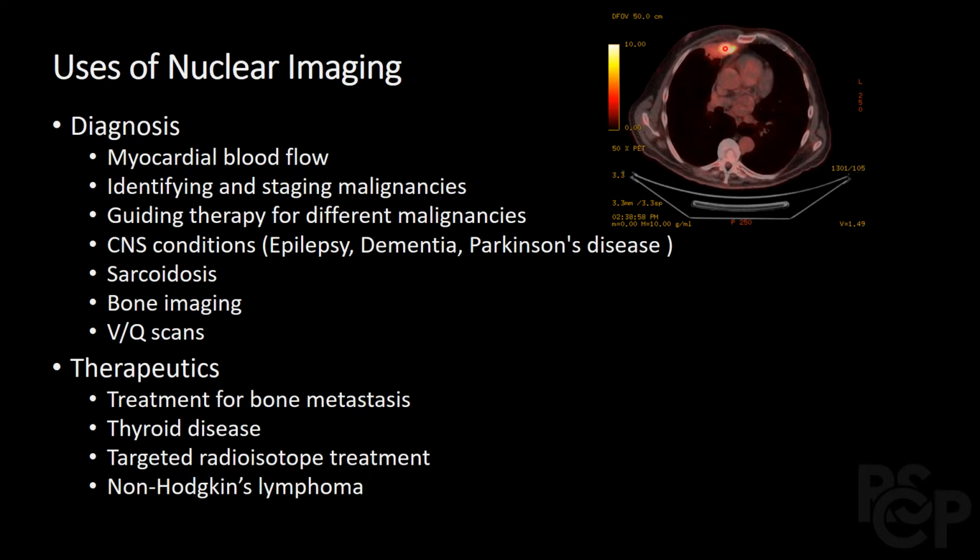Over here is a PET scan image, and we notice this increased area of uptake right here. So the patient was initially given FDG, which is a radiopharmaceutical we'll discuss later on, and the increased area of uptake represents tumor cells. So this can be harder to see on a CT, although PET scans allow for good visualization and we can correlate it with normal CT scans, so we know the areas of increased uptake.